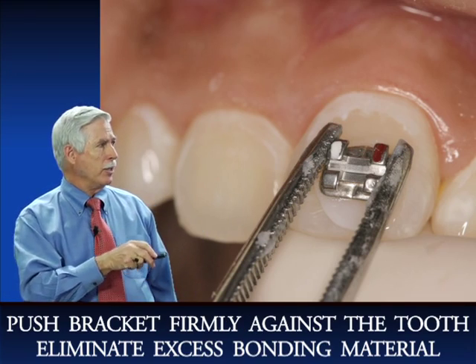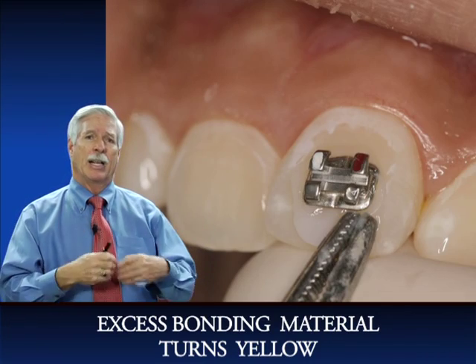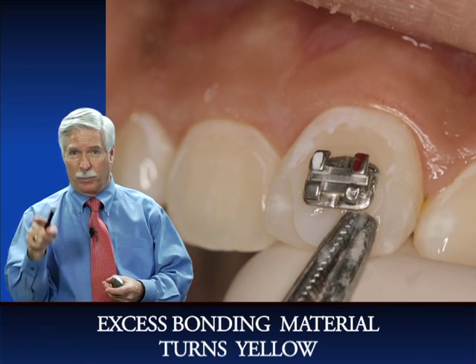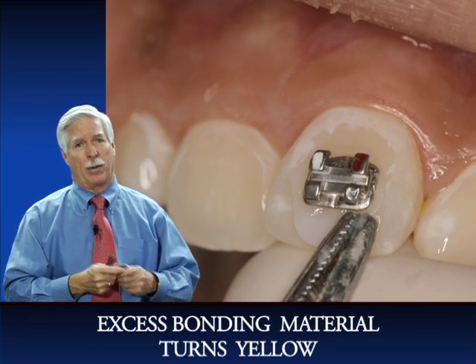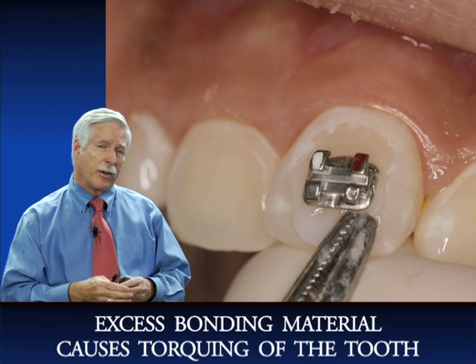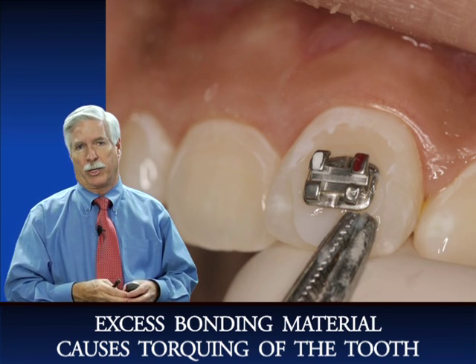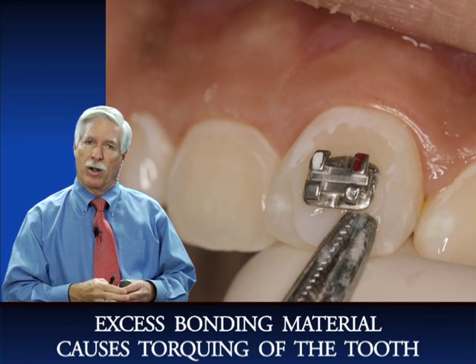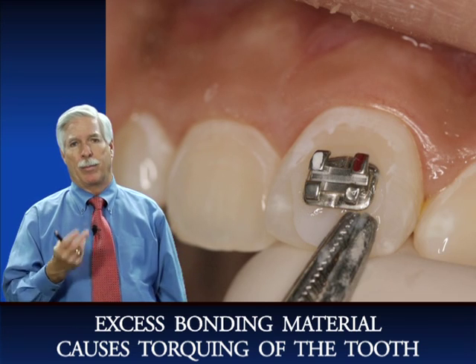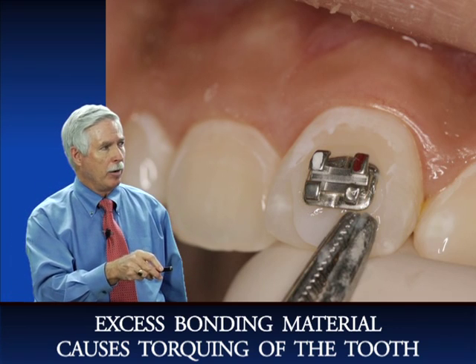You've got to use your instrument to push it right against the tooth, because you want to get all the excess material out. If you don't get rid of the excess material, first of all, it will turn yellow, and you'll see that around the base of the bracket, which is not aesthetically pleasing. Plus, if there's too much material underneath the bracket, you could torque the tooth. It's going to put a torque movement on the tooth, and that's not going to be good. So use the minimal amount of bonding agent, and have the excess come out all around the sides.